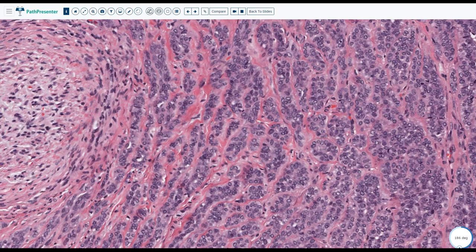All right, so canalicular adenoma can have a trabecular arrangement, and usually it's in the oral cavity. And to be honest, if the whole thing is not resected, I will not be comfortable calling it. Salivary gland, and we may do some dermpath in next sessions, if we arrange that.